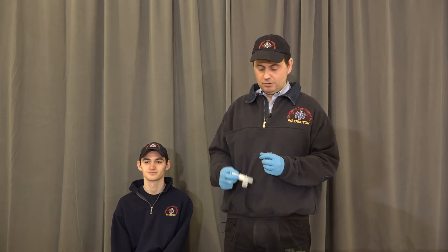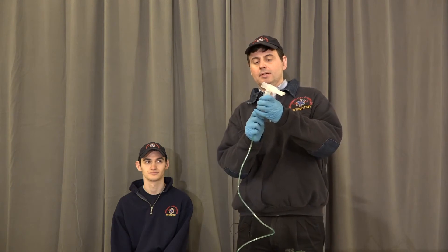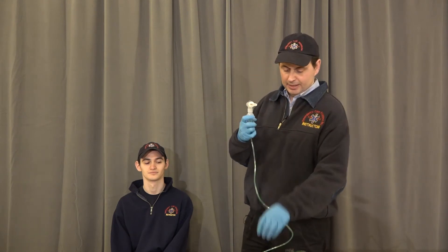What we're going to do is open up the albuterol, pour it into the collection bottle, cover it back up, put the T-piece on the top, and the oxygen connecting tubing on the bottom.